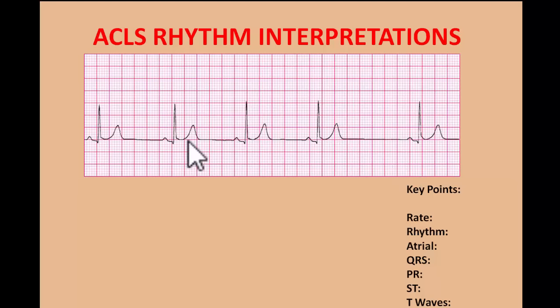Since this T wave looks a little bit different from the other T waves, you may assume this could be a blocked PAC. If all the T waves were identical, then you would worry about sinus arrhythmia, but the RR interval is too long for sinus arrhythmia to be represented in this rhythm strip. So that's how we come up with a diagnosis, by a process of elimination.